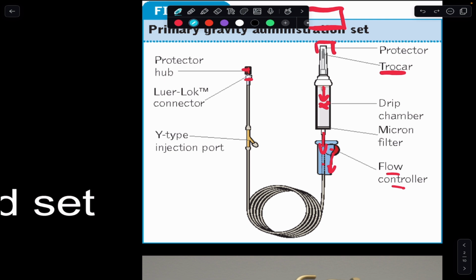When you're pushing medication or flushing medication, a nice little trick is making sure that you're clamping upstream or kinking the tubing upstream. So if you're giving medication, you want it to get over here to the patient. You don't want your medication to flow back upstream into the tubing. It would just delay it getting to the patient. So what I see most anesthesiologists do is when they're pushing a medication through, they'll grab the tubing right here, form a little kink in it, and then they know that their medication is going in this direction.